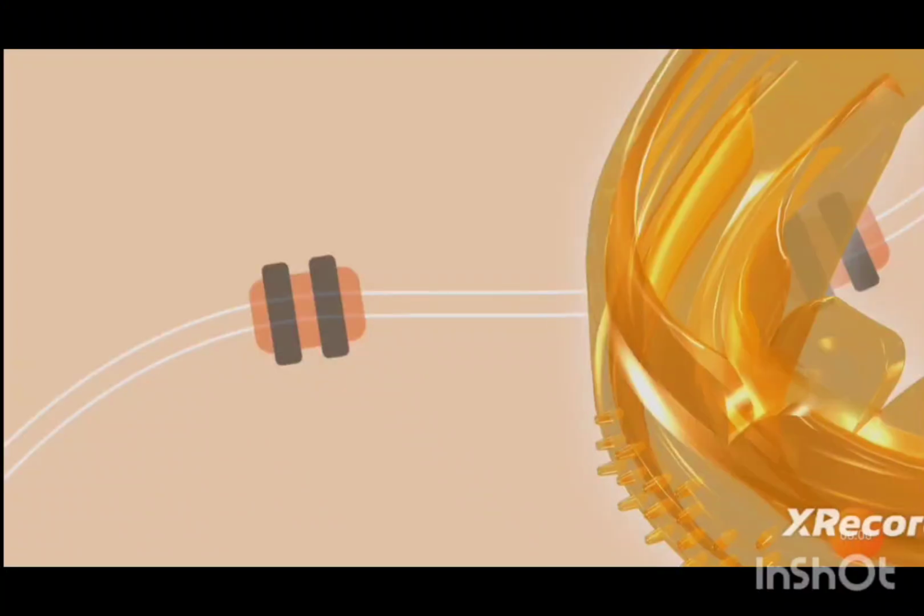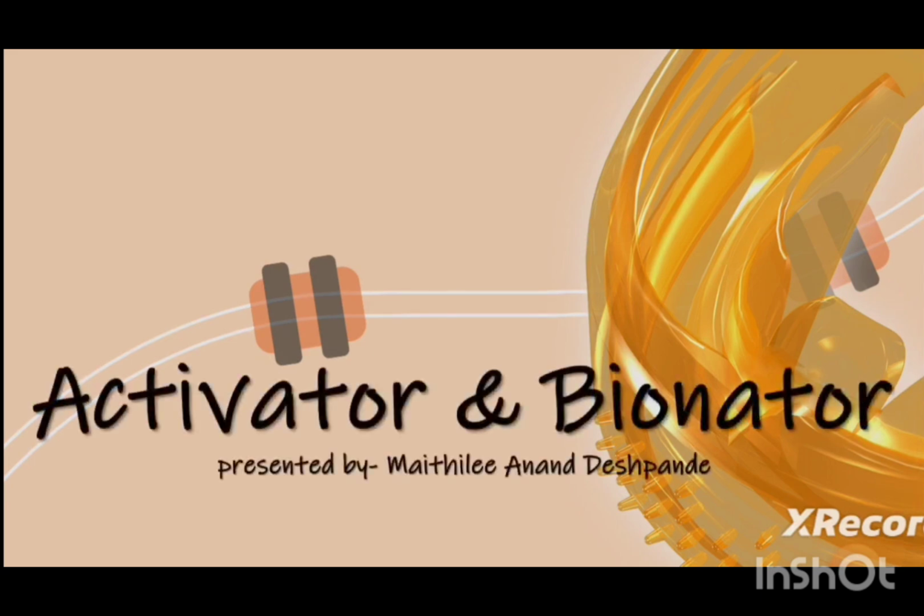And today we'll talk about myofunctional appliances, more briefly about activator and bionator. Let us begin. So we all know that myofunctional appliances are based on the principle of application or elimination of forces to bring about musculoskeletal development. Now since we're talking about activator and bionator, let us begin with activator first.